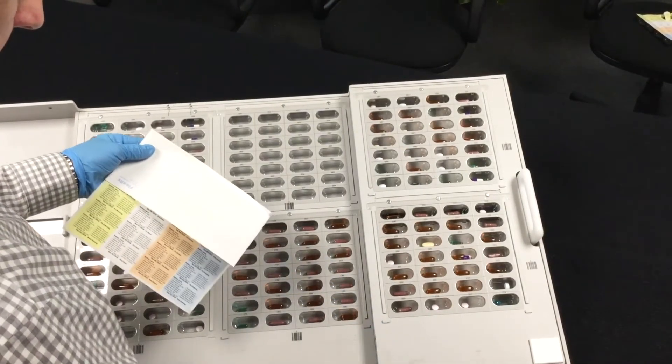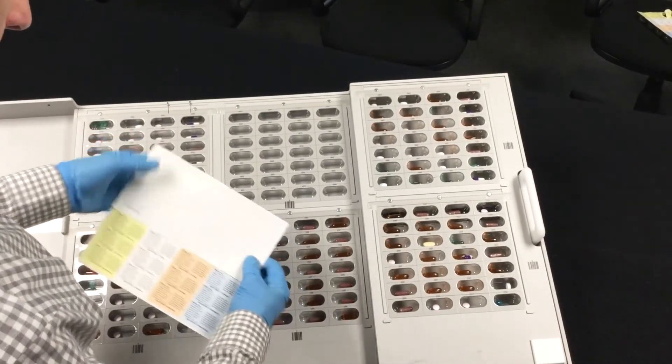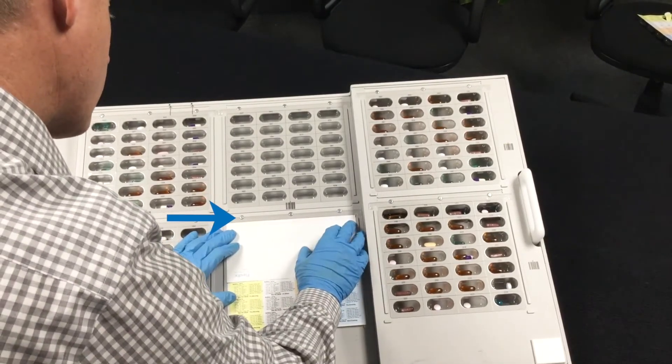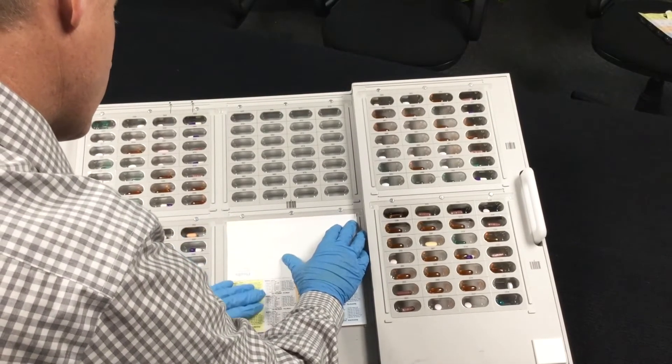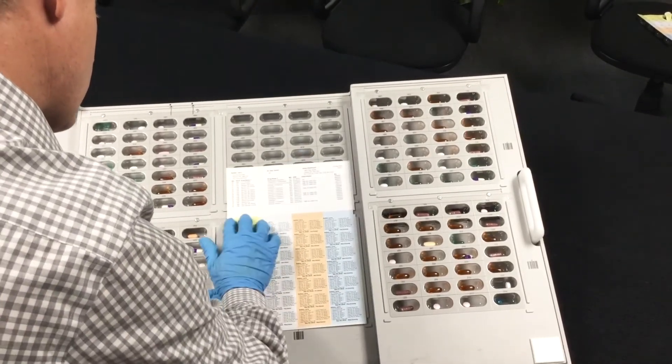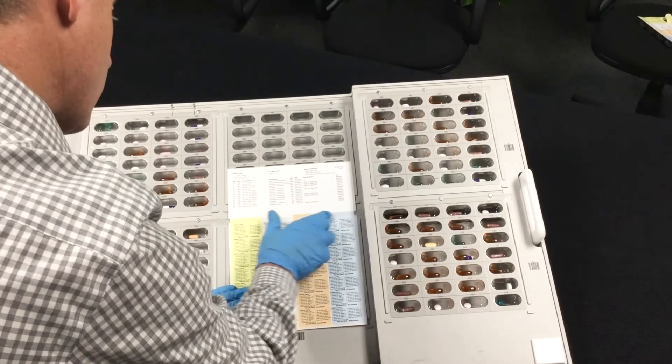With the colored side facing up, align the folded edge of the label with the perforation line at the top of the blister. With these elements aligned, steady the label in the middle of the tray with one hand. Use your other hand to fold the top part of the label towards the tray. Firmly run your finger over the adhesive strip.